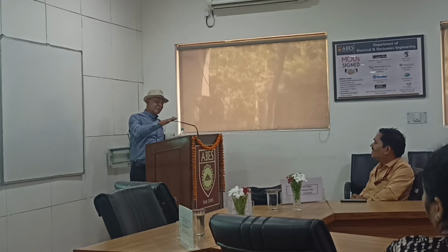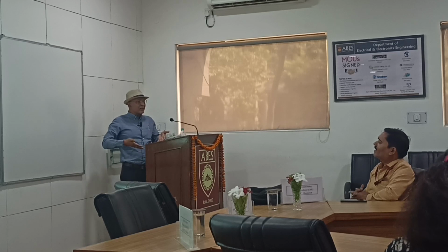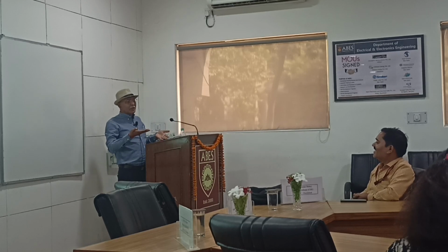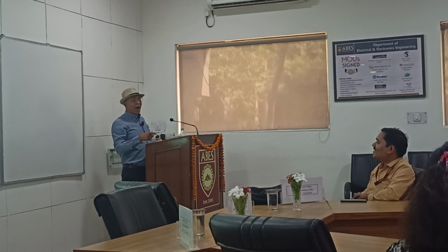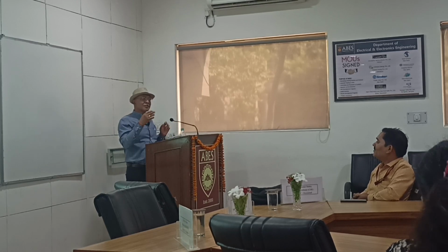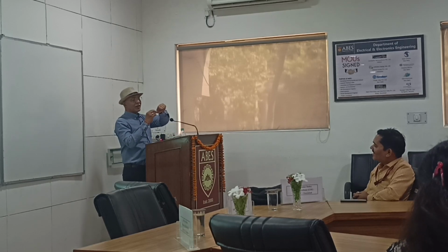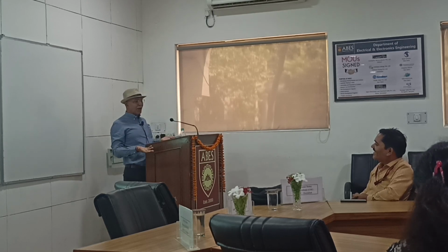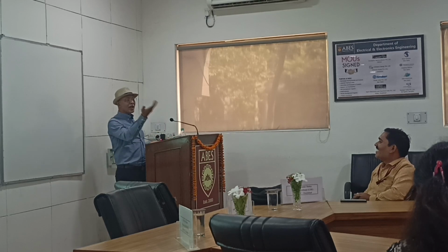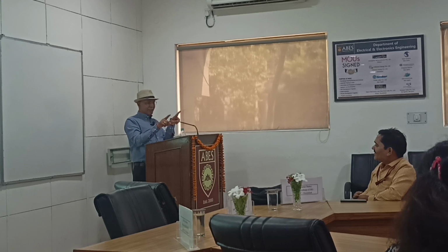Normally in the abdomen case, when you go for an ultrasound, whether it is for pregnancy or otherwise, you will find that rarely there is hair there. Hair on the belly, where will it be, right? So there you can address it, but for this you have to remove hair. And once you are doing this much, what is the problem in applying gel? If you are sacrificing hair, apply the gel also. Such a big sacrifice is being made. So that's why the two problems are distinct from that point of view.